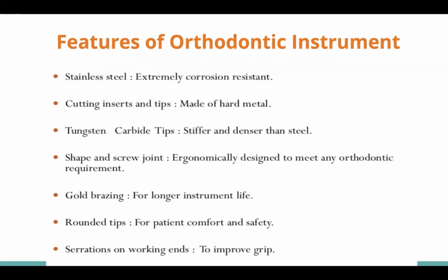Whenever you buy the instruments, you can show me which ones you are buying and I can guide you. You can even visit my clinic if you're available, or show me close-up pictures of the tips and the beaks, so you know they have all the requirements we need. Especially if you are paying a premium price, make sure they have serrations and a rounded tip.